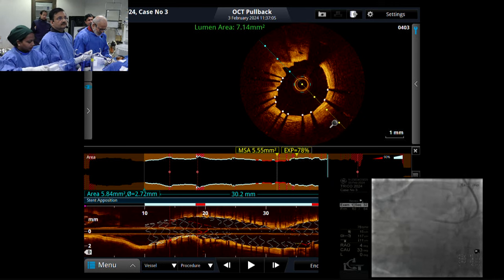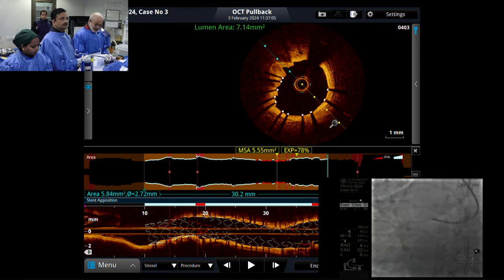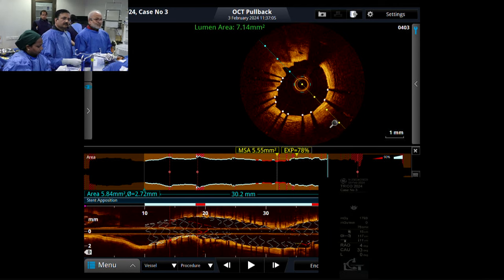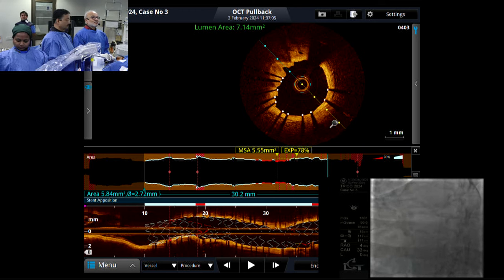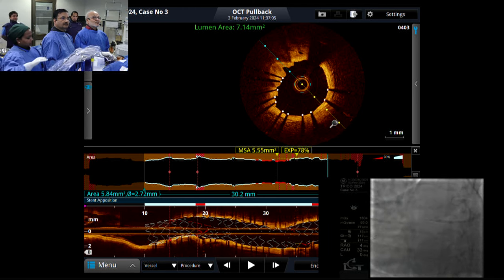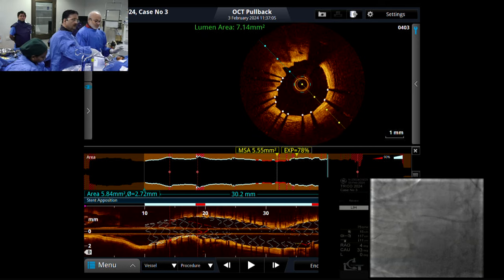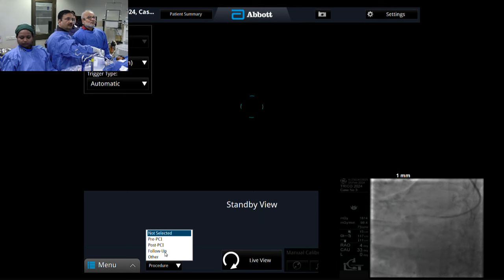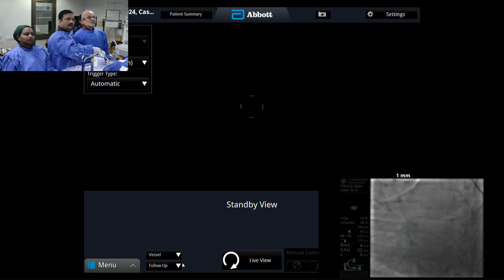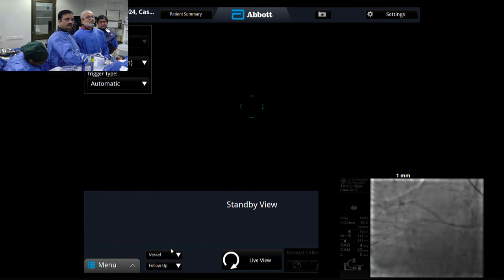I want to go back to your question in the earlier session, Samir, about stent optimization. We know that, at least in modern or contemporary studies, this is only achieved in 55% or so. If we look at the most recent study, the Renovate complex PCI study, there is a hint that with stent optimization achieved, MACE is a little bit lower. We don't really know the magnitude, but you're asking me, is it two times, five times? I don't think it's of that magnitude.